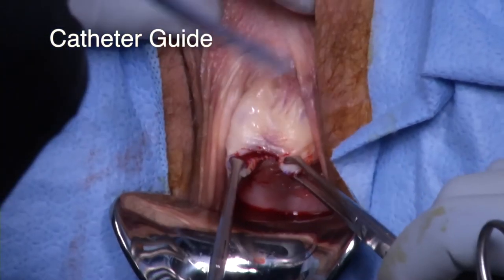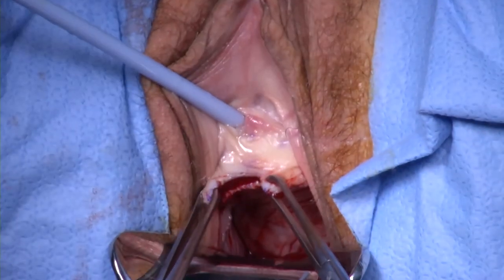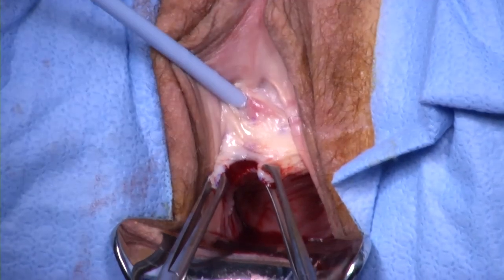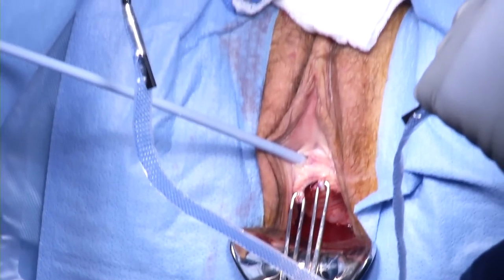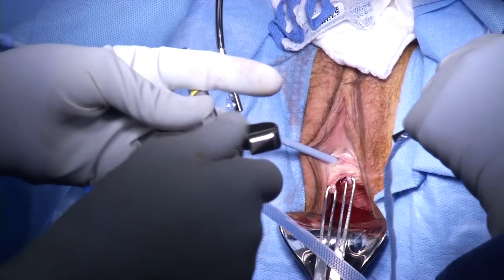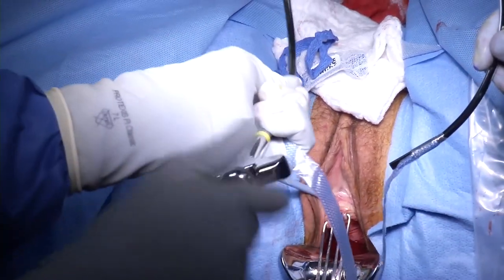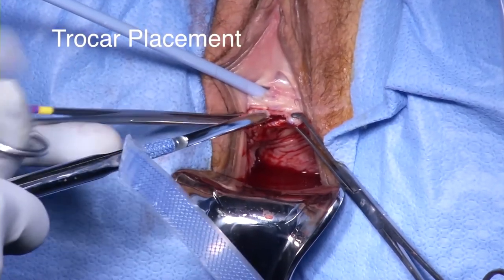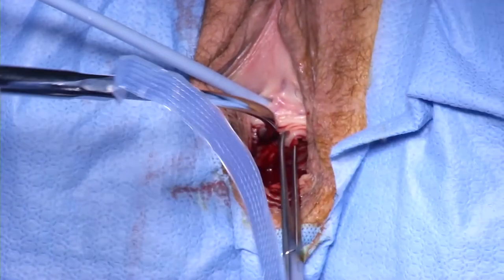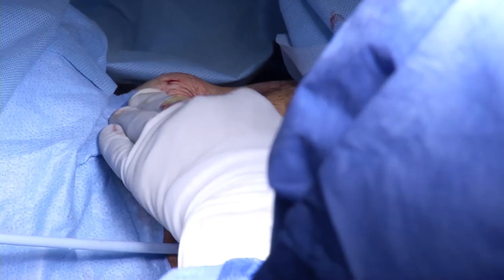The bladder is now emptied. The Foley catheter with the catheter guide is then carefully placed into the urethra and attached to the drapes over the patient's leg to deviate the urethra and the bladder neck to the contralateral side. The trocar handle is attached to the trocar. The trocar needle is passed into the dissected vaginal space with a trajectory towards the ipsilateral shoulder, placed under the pubic bone before curving it up to the pre-made suprapubic stab wound.